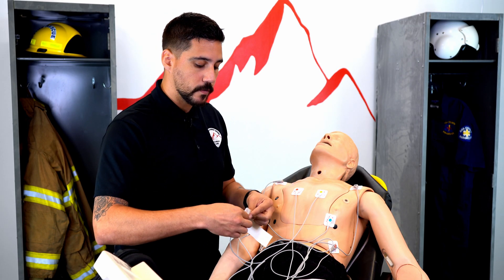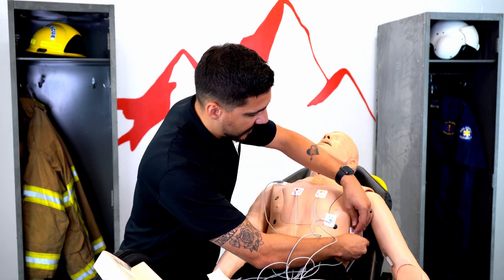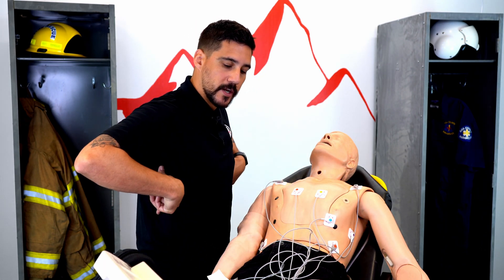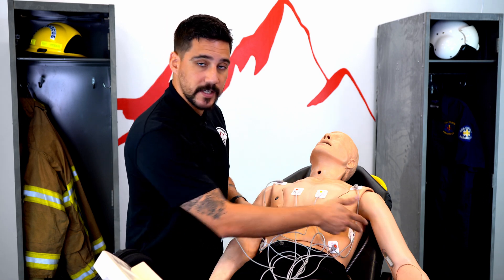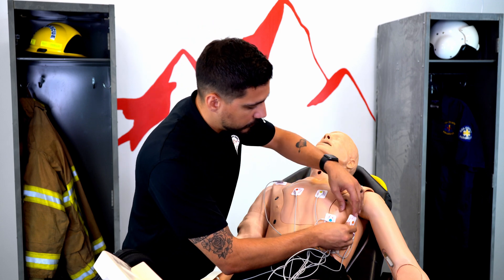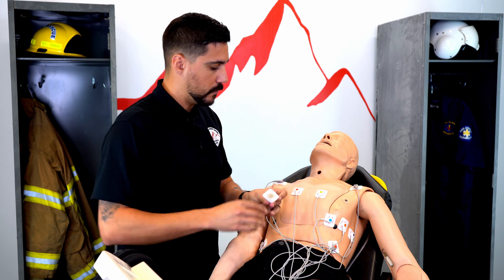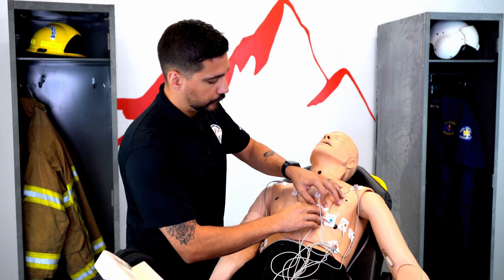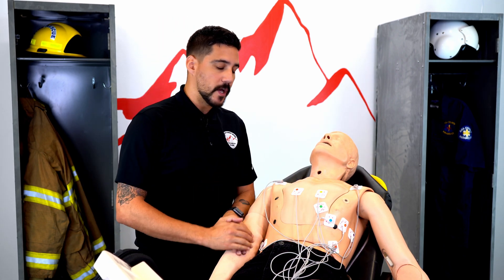We then skip V5 at this point. V6 will be at mid-axillary — if we were to cut the body in half front to back, that is the line we're looking for. Now that we have V1, V2, V4, and V6 on, the last two are easy. V5 goes in between V4 and V6. V3 will go in between V2 and V4. This will allow us to get a good tracing if we have everything placed correctly.